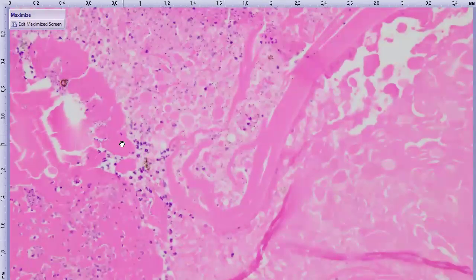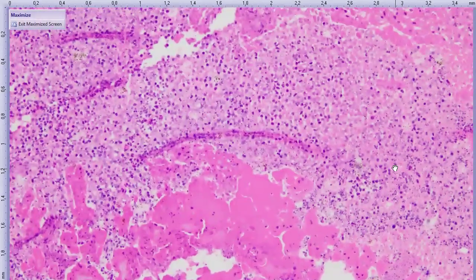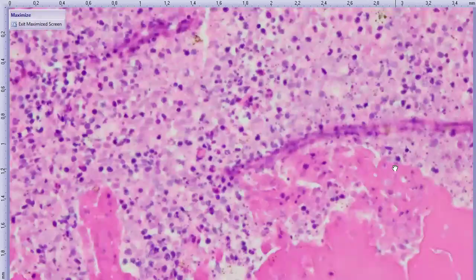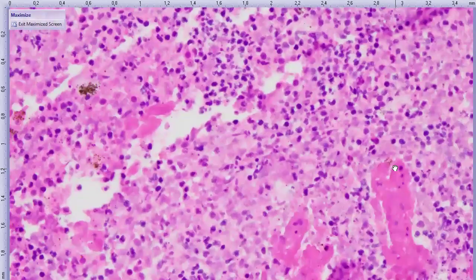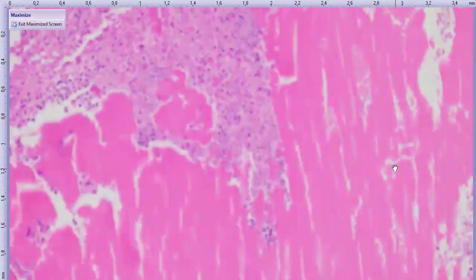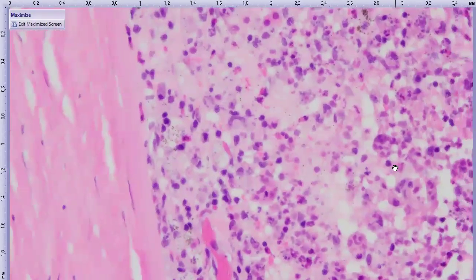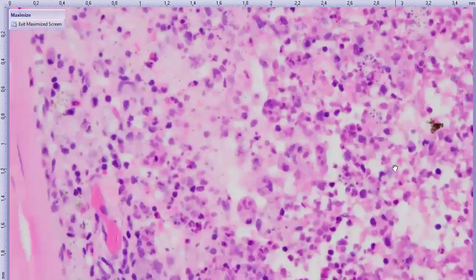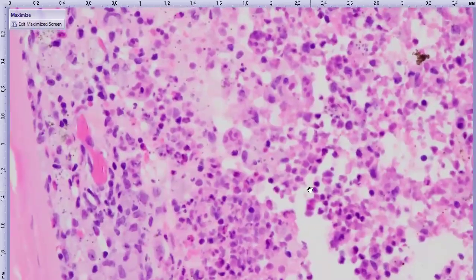And we can see all of these liquefied and degenerate lens fibers that are extruding out from the lens cortex and into the chamber here. These lens fibers are accompanied by a mixed population of heterophils and macrophages. Some of these are big and foamy. Occasionally, some of them are multinucleated, and there's a lot of phagocytosis of debris in here.